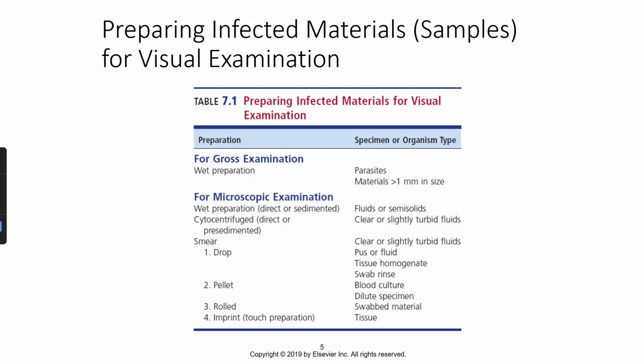We can identify trichomoniasis, and trichomonas is a very common STD, but it's a small parasite that has a little flagella on it, and you can see them spinning around in the microscope if they're still alive. So as long as you get that specimen received into the lab pretty quickly, we'll be able to see those spinning trichomonas organisms. And then we can also see clue cells.